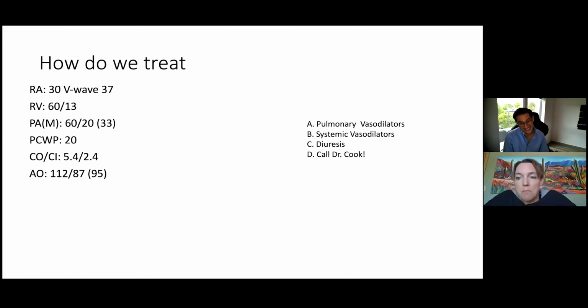Yeah, and that's what this patient got. And just with that, as we described in the previous case, the patient opened up, honestly. Because if we go back, and I don't think we have these equations here, the patient definitely has elevated right-sided filling pressures and pulmonary hypertension.